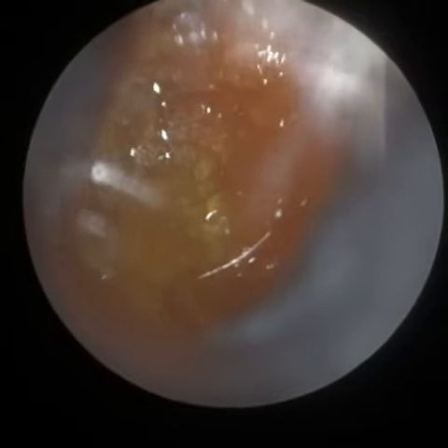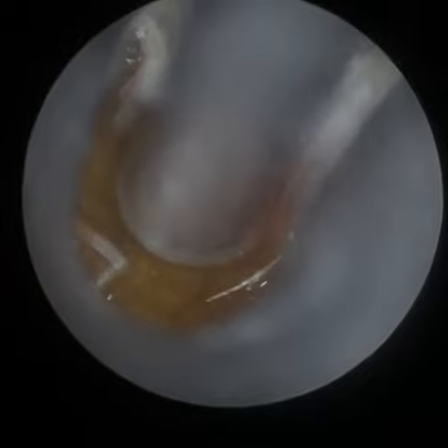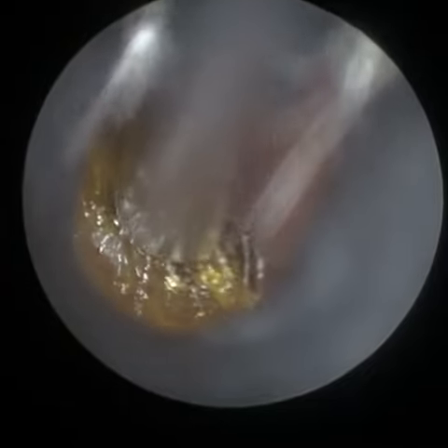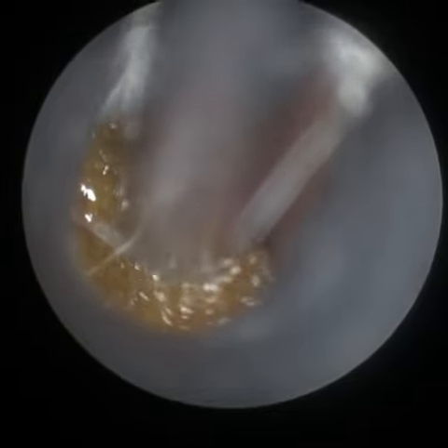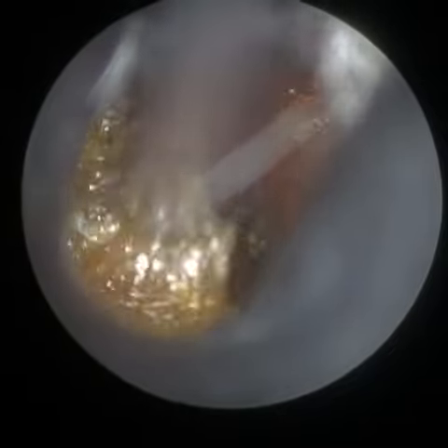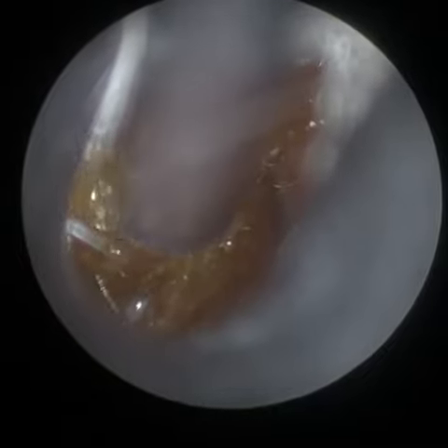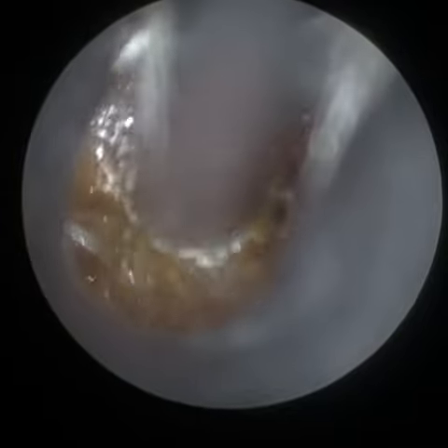I've now reverted to the Waxscope and I initially affixed the 4.25mm speculum, which was slightly large for this patient's ear, given that they've got quite a narrow, bendy ear canal. So I've just exchanged that for our smaller speculum size, which is 3.5mm. You can see that the speculum fits perfectly inside this patient's narrow ear, and I've then rotated the speculum to stretch and straighten the patient's ear canal.